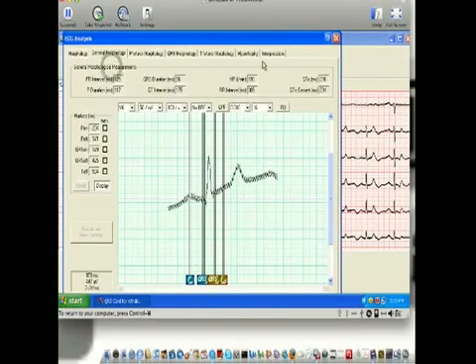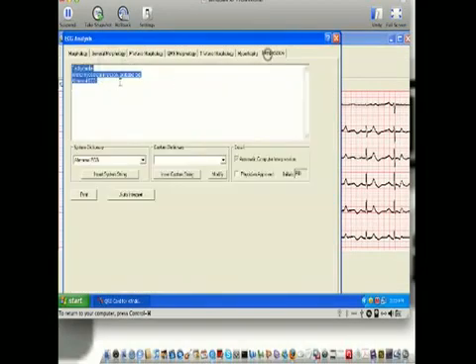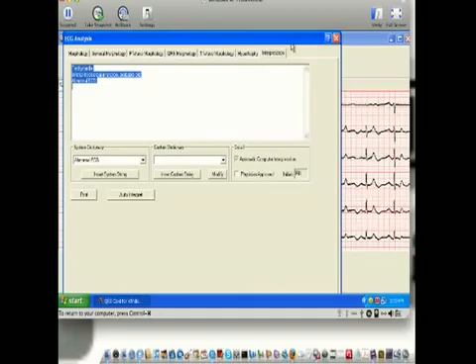Yeah. Look at the measurements there. The interpretation was that you had a static lead issue. That means no. Well, I had one lead fall off. That's why that was the problem.